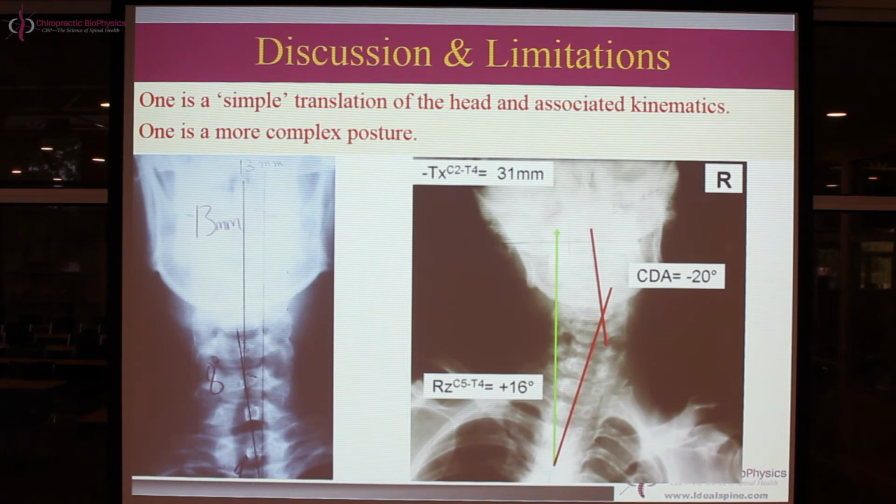Now, what is it? Well, maybe it's an artifact of the X-ray positioning technique. If the person was slightly twisted relative to the X-ray when the examiner took the film, that can explain some of it. The other thing is, this could be a true cervical thoracic scoliosis that we have to worry about. Now, I'm going to share this case with you for next week. We'll go through that and I'll talk to you about what that really is. For right now, I'll give you a hint.